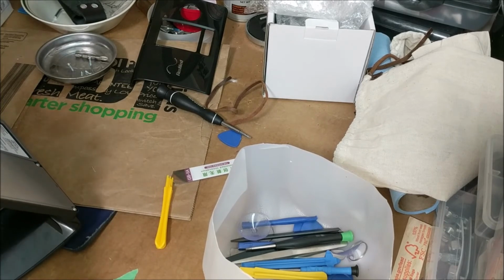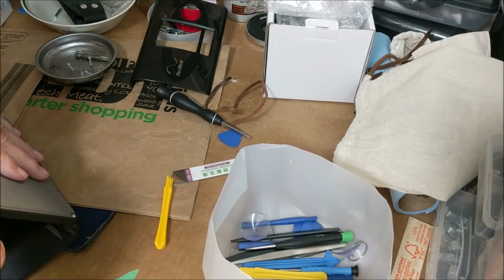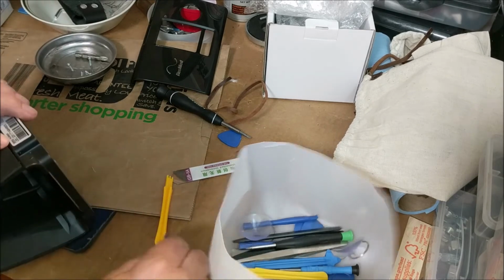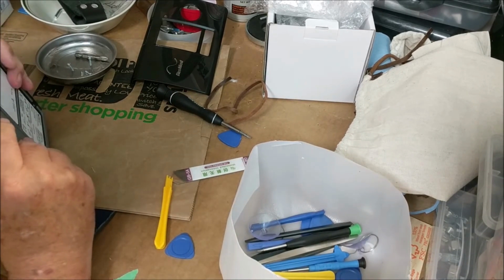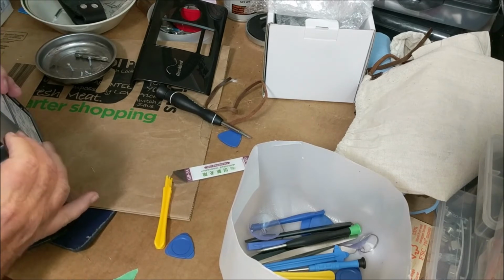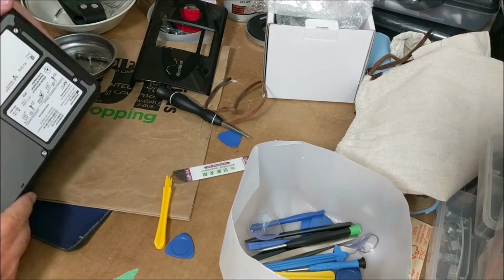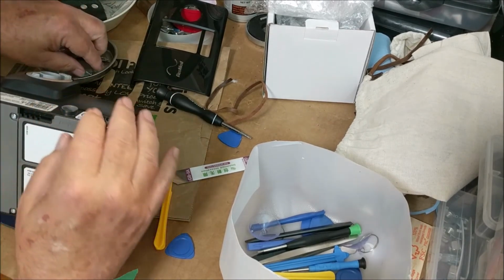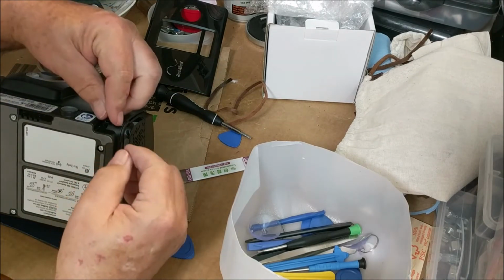Thought I had it in there. Of course, you always think you do. There we go. And we put 2 screws in the back.